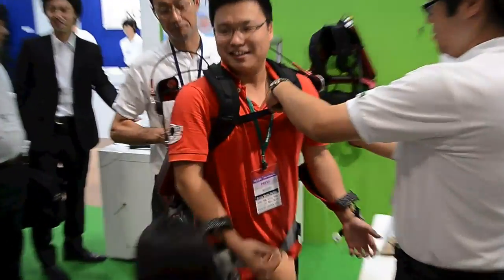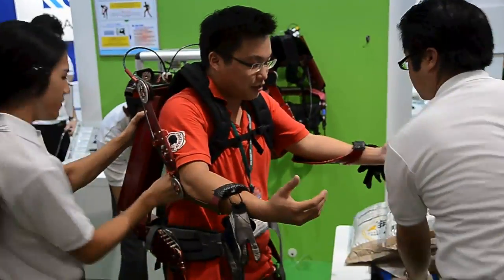I feel like an Iron Man. This is a university project.